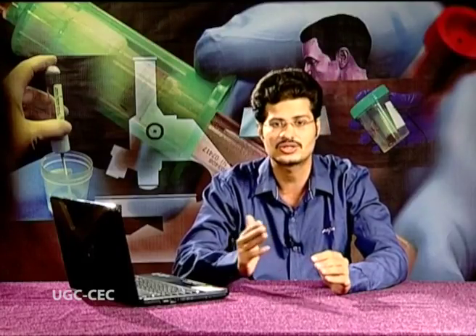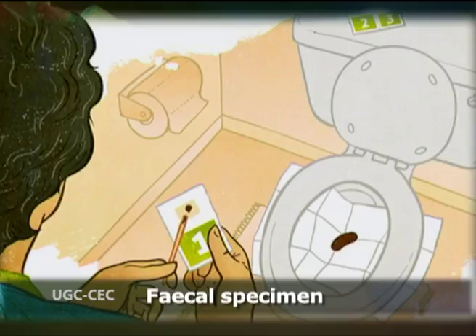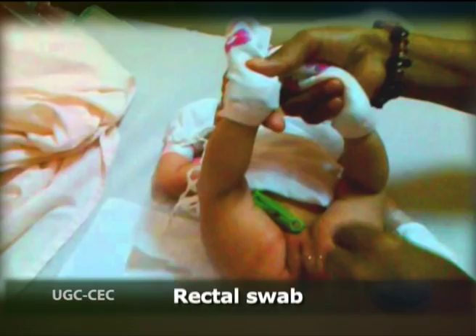Please specify whether the sample is a routine, that is screening sample, or an investigation for suspected intestinal infection. If viral gastroenteritis, for example norovirus or rotavirus, is suspected, the stool specimen should be sent to the virology laboratory. To exclude a bacterial cause, a second stool specimen can be sent to the microbiology laboratory. A fecal specimen is more suitable than a rectal swab.